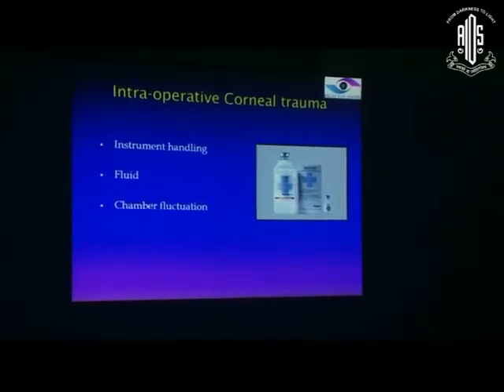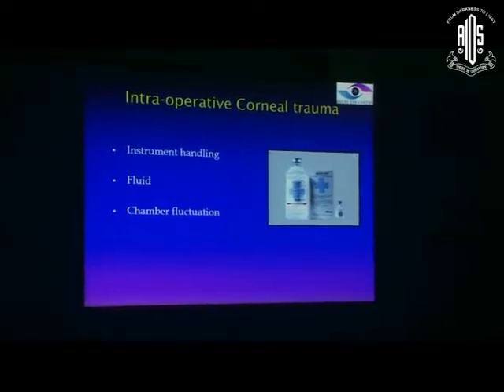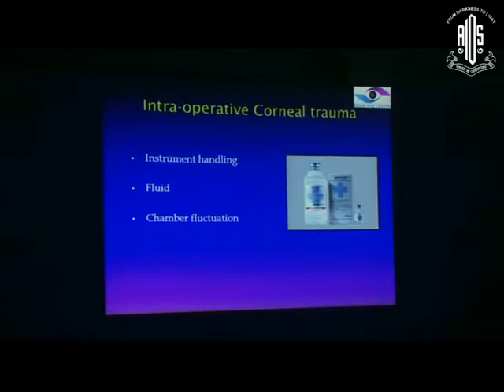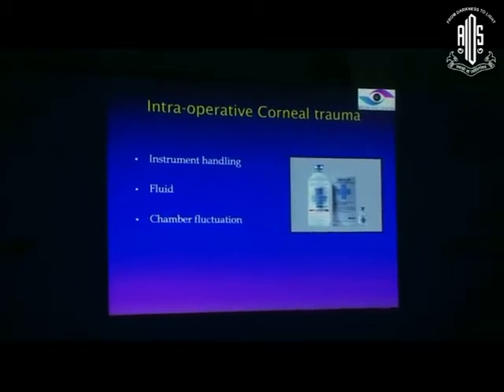The intraoperative corneal trauma can also be caused by improper handling of the instruments, so we should be very, very careful while entering and taking the instruments out of the anterior chamber. Sometimes we can cause inadvertent DM detachments while doing this. Also, we should keep looking at our left hand, whether the chopper is anywhere close to the endothelium.